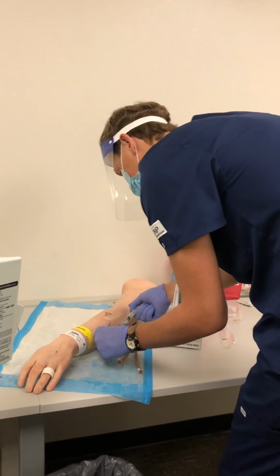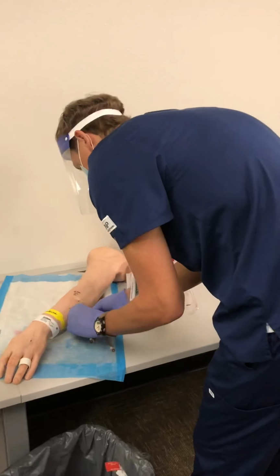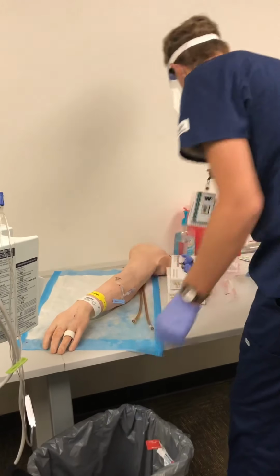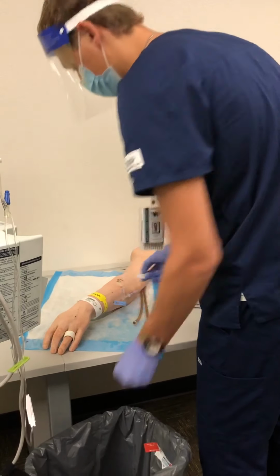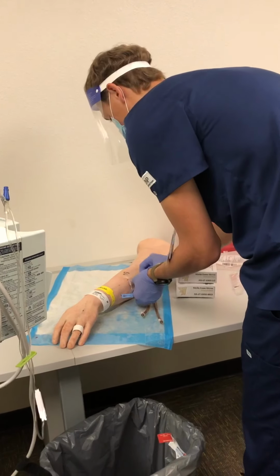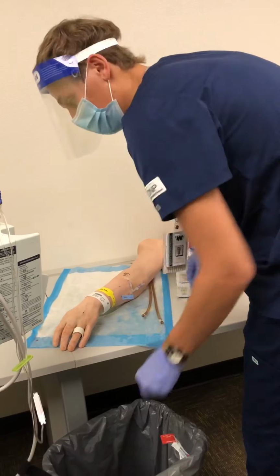Instilling saline flush, and then I can relock the saline lock, take this off, and clean one last time for good measure, so that when the next person comes in, they can also clean it. This is just to prevent any other forms of infection.